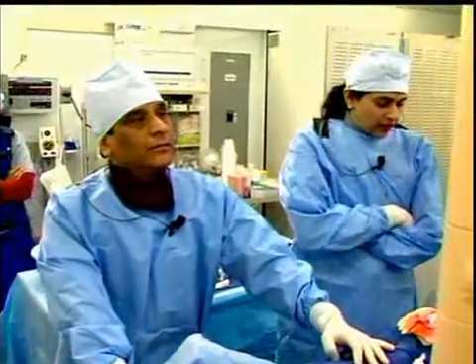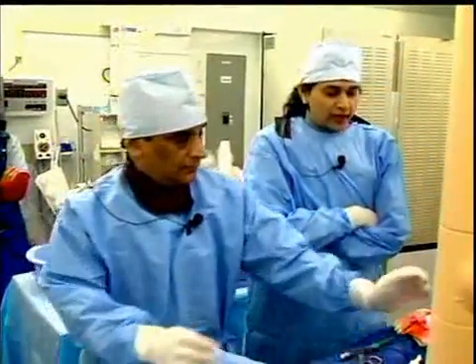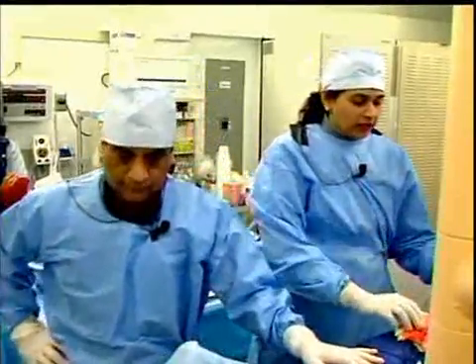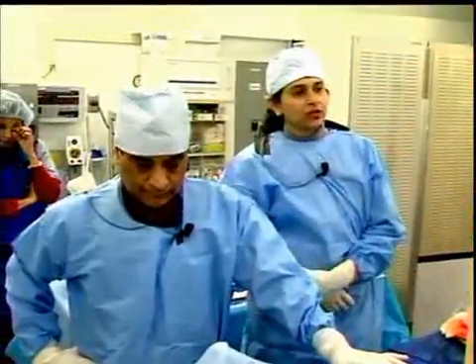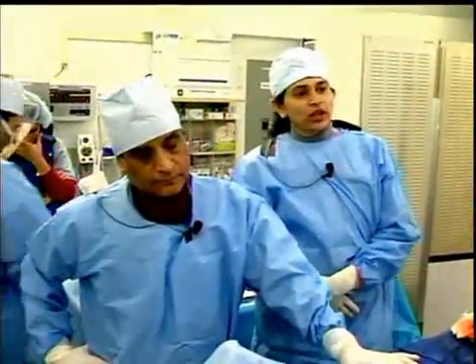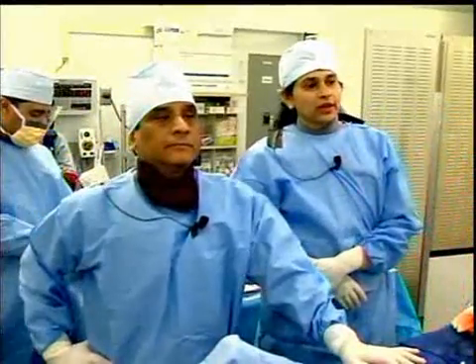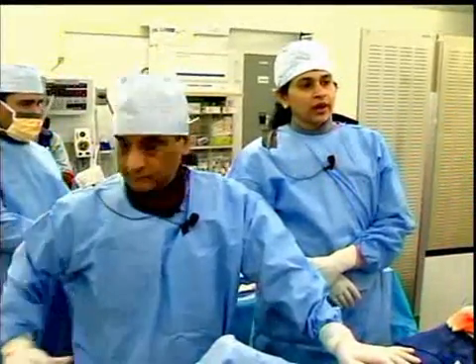The only thing, I think, just like you mentioned, every interventionalist, as we are trying to go to the next level, higher level, and trying to do tougher cases, we've got to know our limitations, and that's what we did in this CTO. Once we knew we were subintimal and not reaching the distal vessel, don't dissect and make the vessel worse.